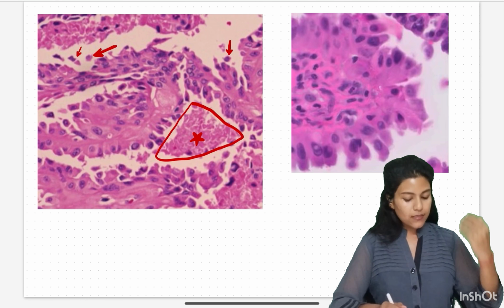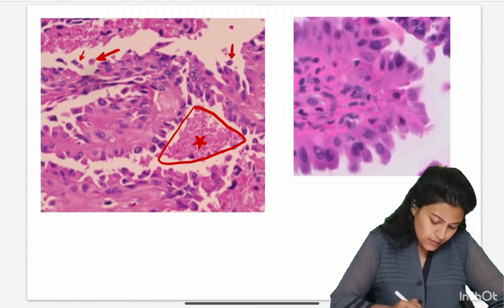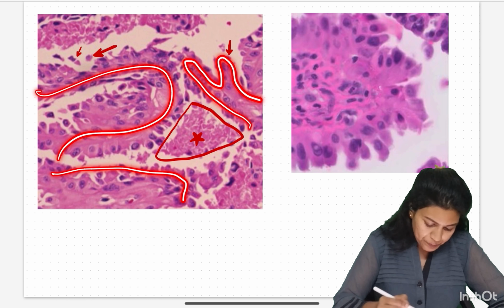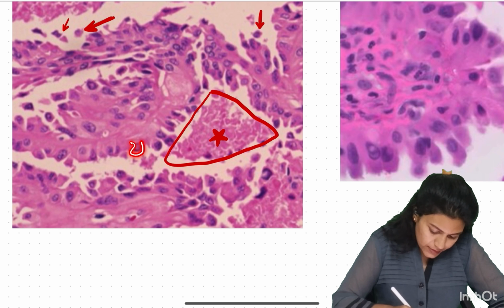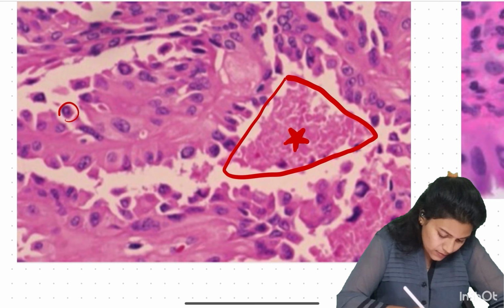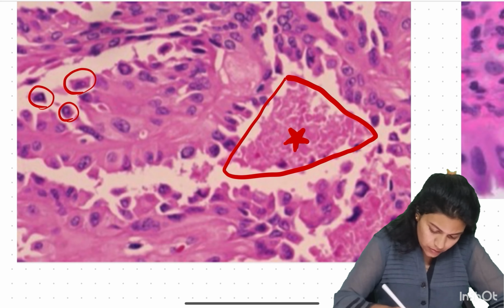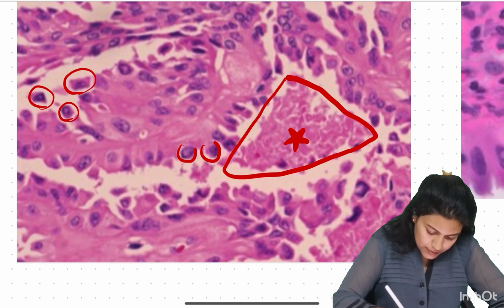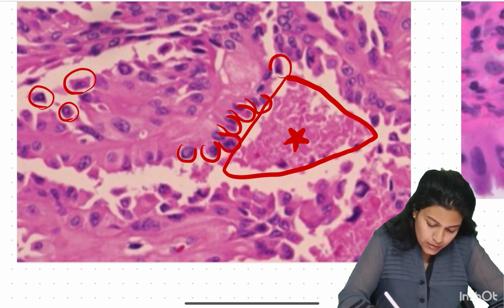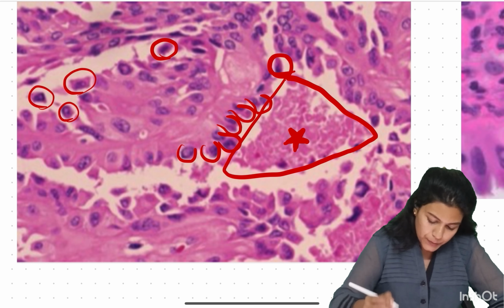Here in this histopathology slide, these are the papillae. Here hobnails are seen lining these papillae. That is the apical bulging. Here the individual cells are scattered because of loss of cohesion. These are the hobnail cells coming out from the papillae, bulging out into the lumen. These are again the individual cells.